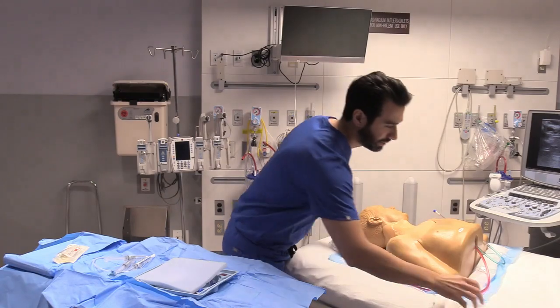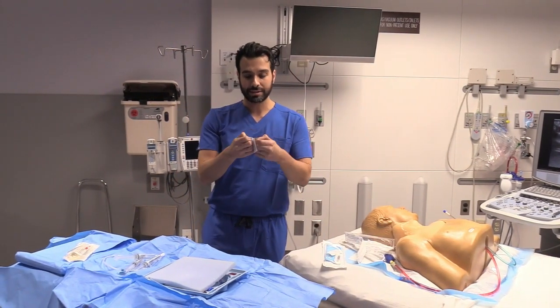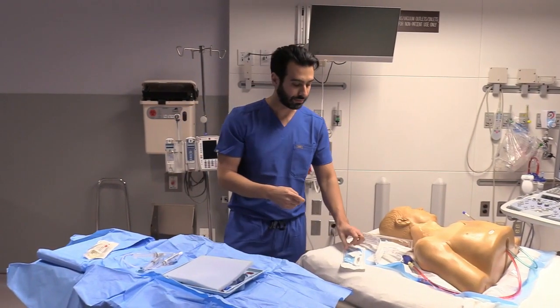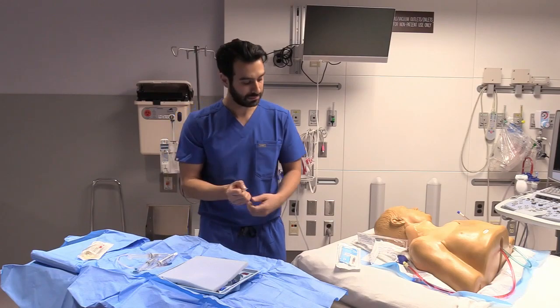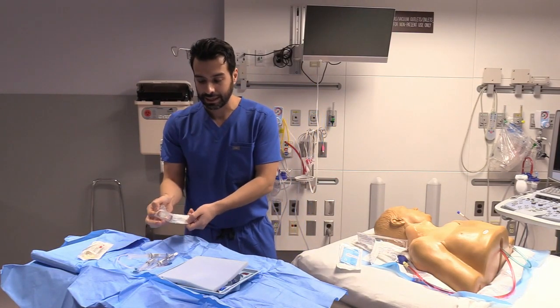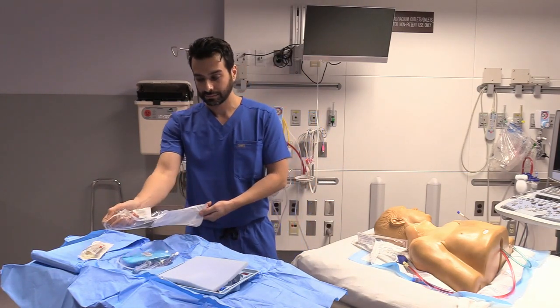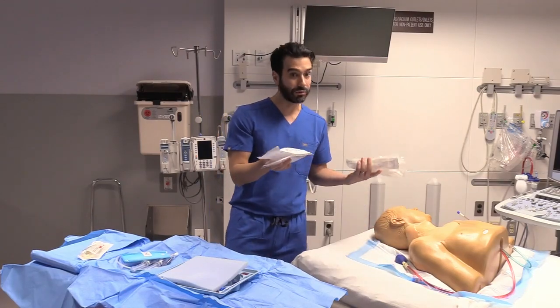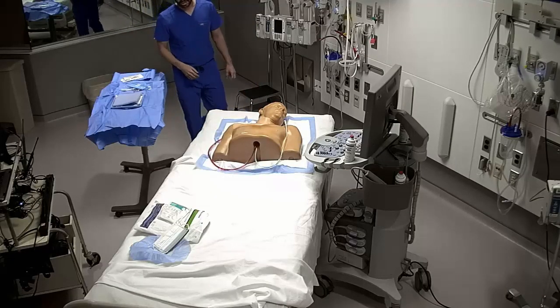3 saline flushes, the caps for the central lines that we have here, and you'll need 3 of those. And then you're going to need a probe cover. So once you've got that, you're going to throw this equipment into the garbage. Not going to use that anymore, and now you're going to get sterile.